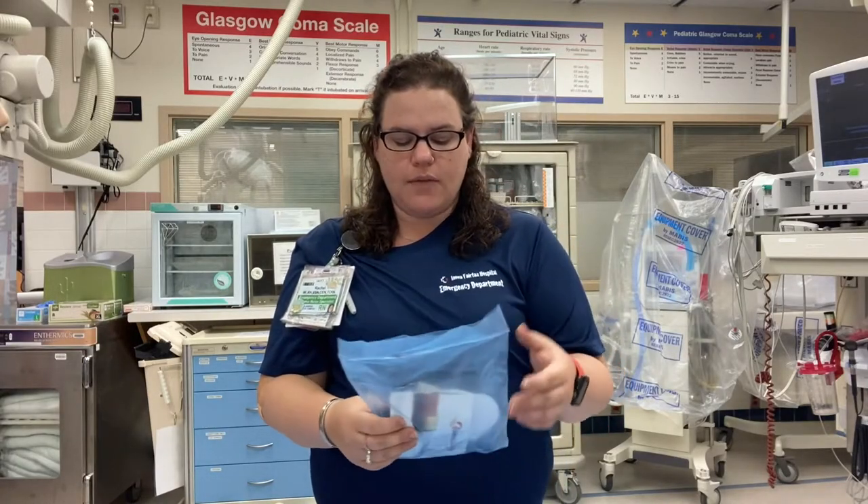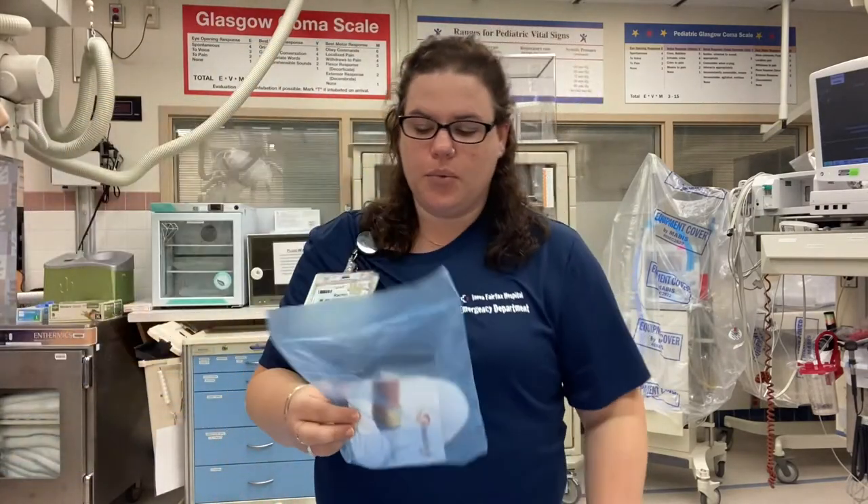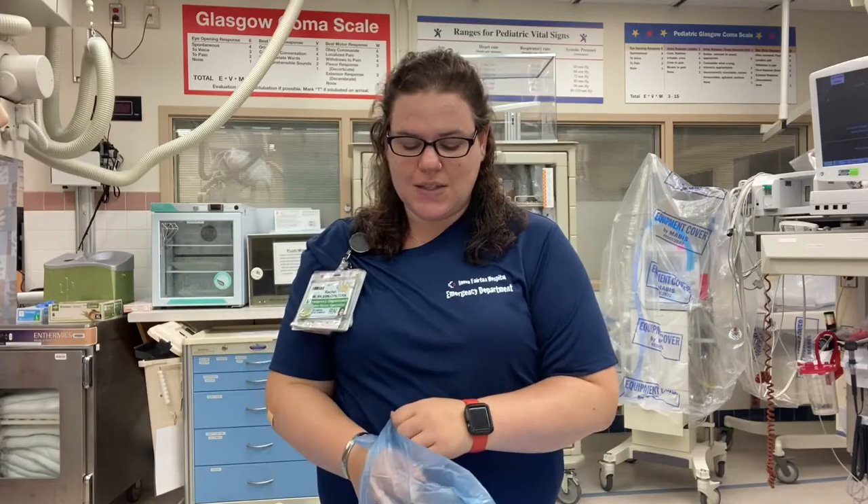Now we're going to talk about the male external catheters. We do still have condom catheters in the hospital, but we also have these nicer ones for male patients in supply in the same place where we keep the condom counts. These are safer for male patients because they cause less skin breakdown, especially around the head of the penis. With condom catheters, urine can sit on the inside and start to break down the patient's skin.